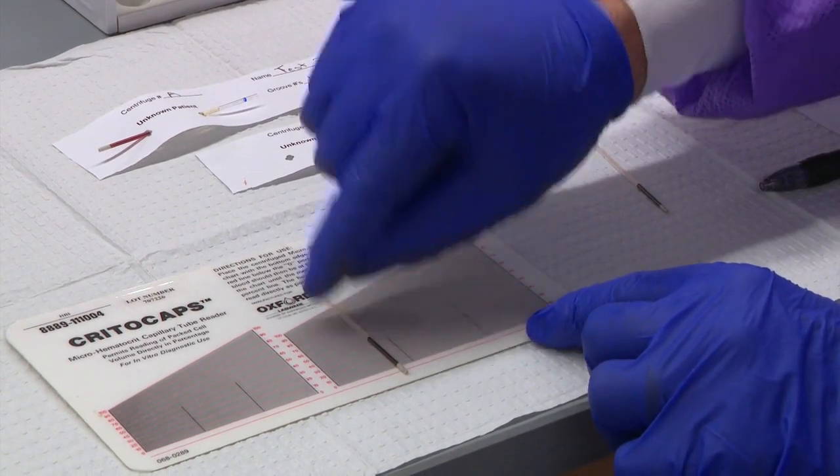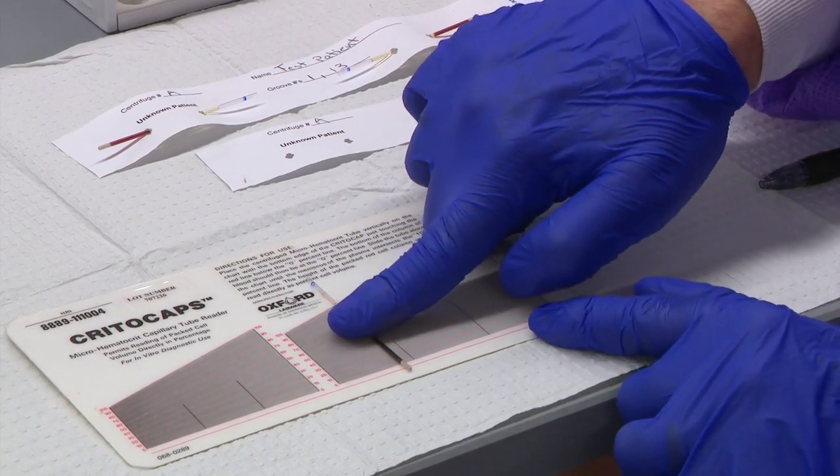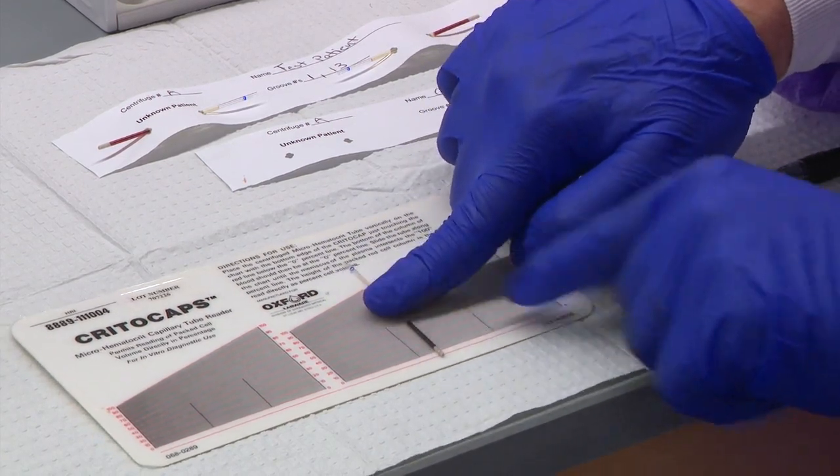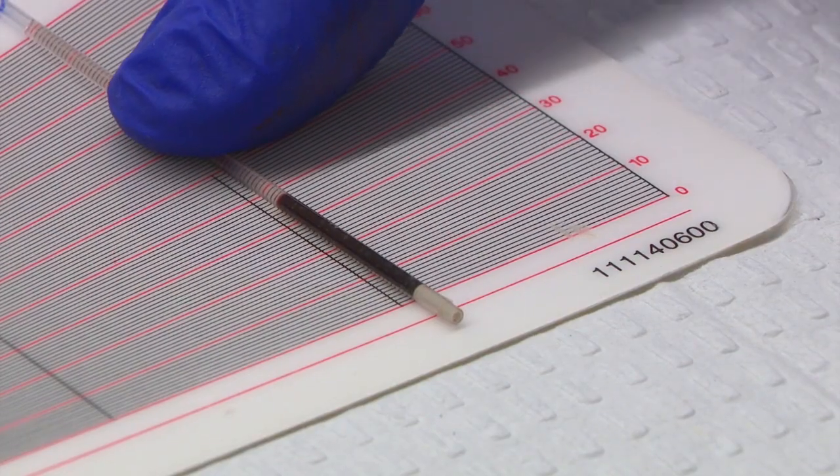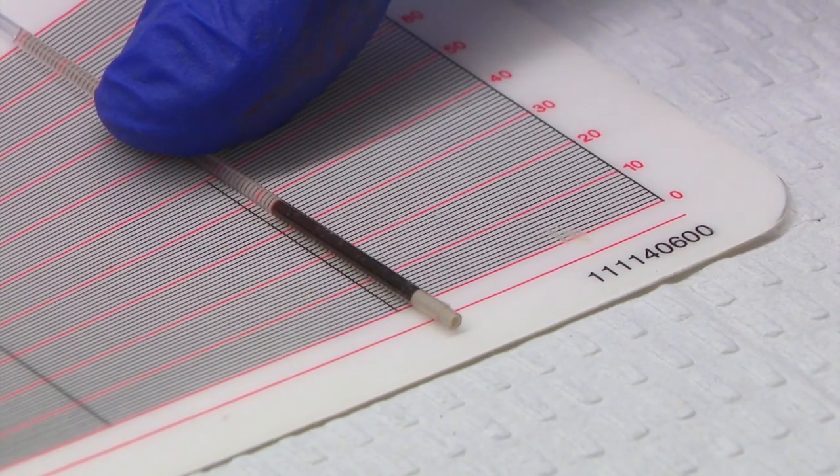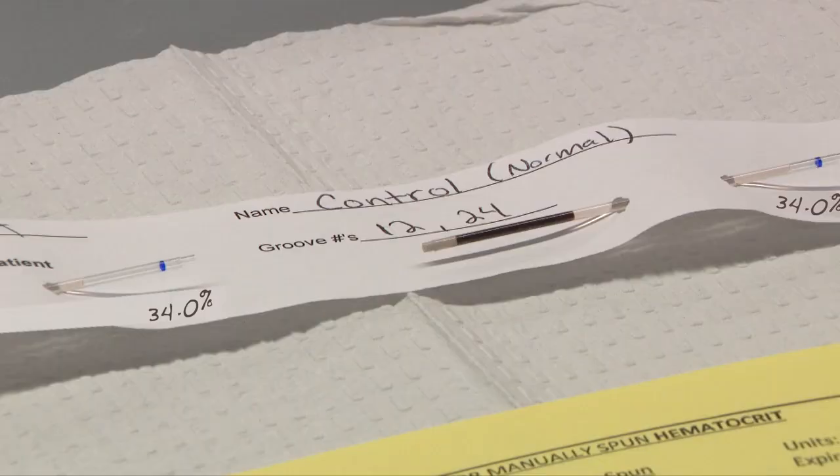We are going to read both control hematocrit tubes and in order to accept the results, the values must agree within plus or minus 1 percent. The 1 percent equals one hematocrit percentage point. Our first control tube is 34.0 percent and our second control tube value is also 34.0 percent. Since they agree within 1 percent of each other, we can accept those results.